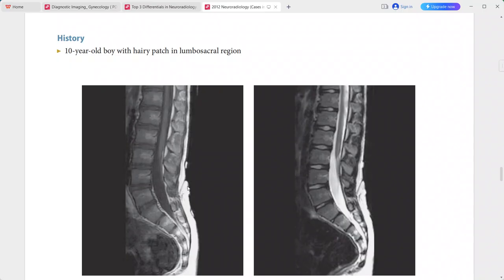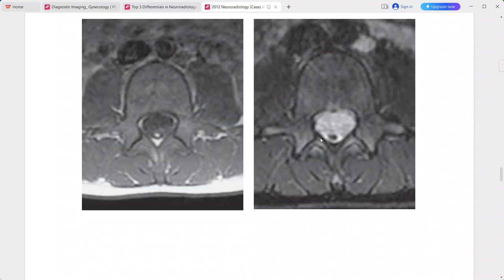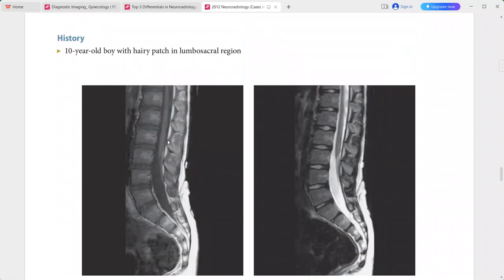A fibro-fatty stalk which is hypointense on T2 and hyperintense on T1-weighted images. This stalk extends from the conus medullaris to the dorsal spinal canal at the level of L5.